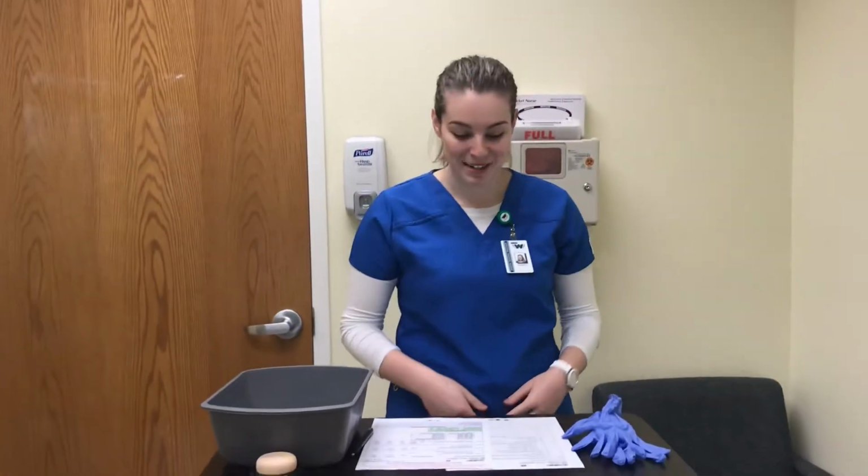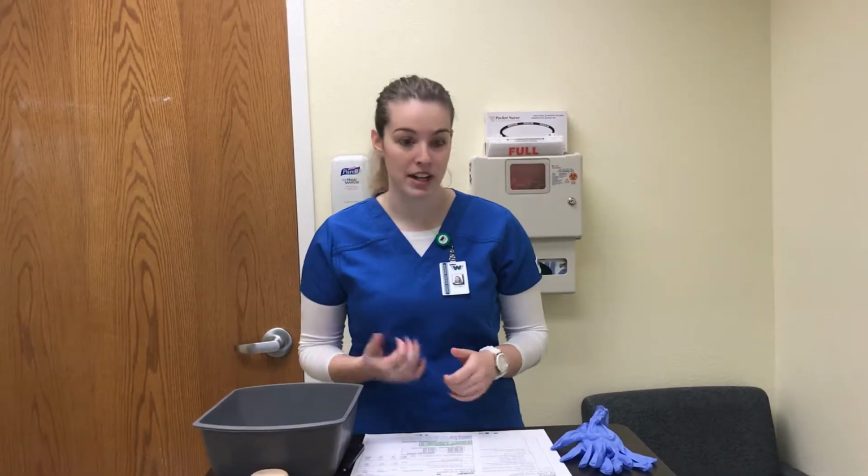Hi, my name is Andrea Green, PN student, and today I'm going to be demonstrating mixing and administering insulins through injection and a pen as well.